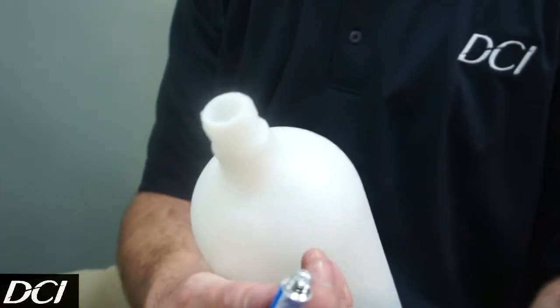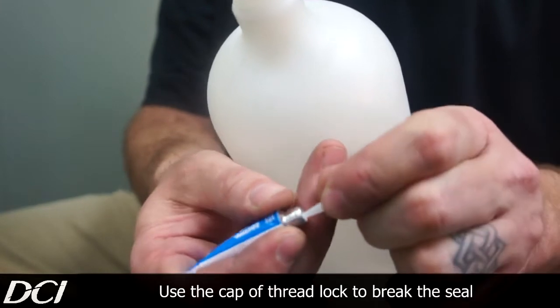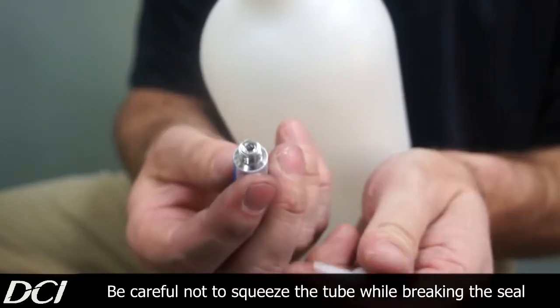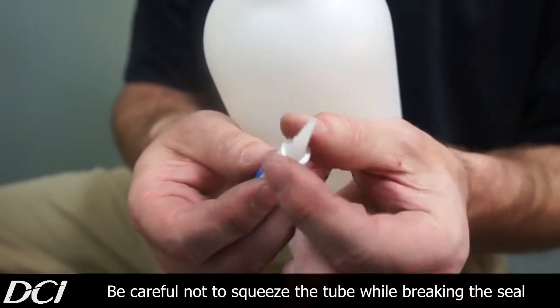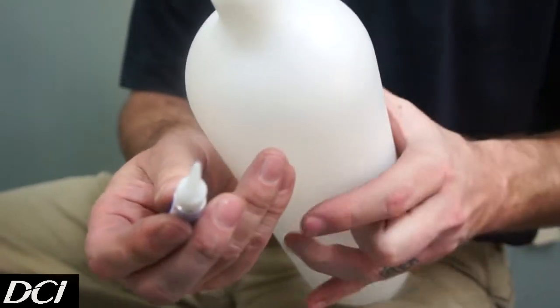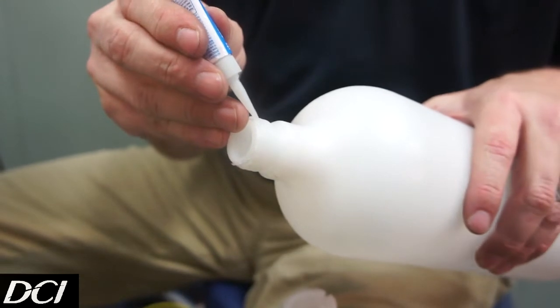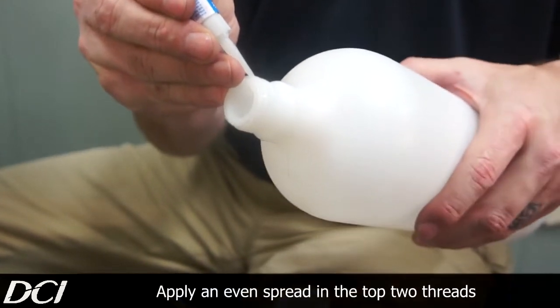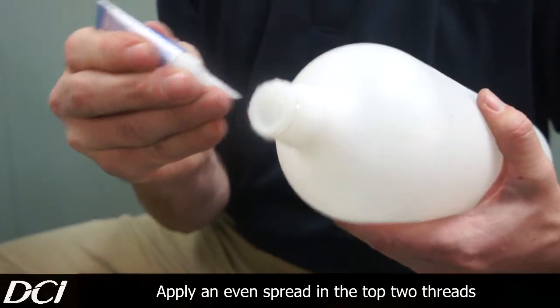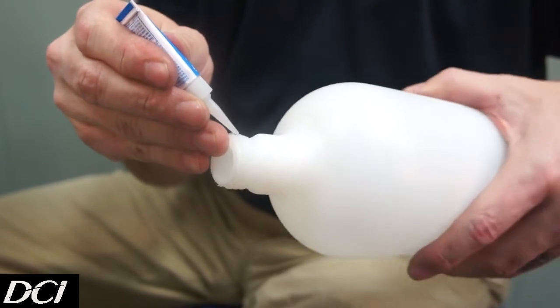Then we take our thread locker. Since it's a new tube, it's going to be sealed on the end. Carefully give it a quick poke through there and screw it back on. We want to apply that to just the top two threads — not all of it, just those top two. This is going to keep that manifold that we put on there from unscrewing itself.